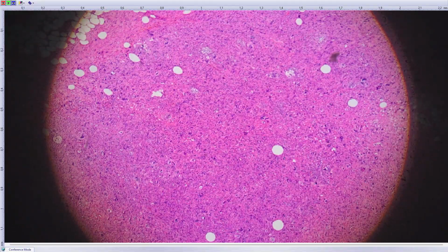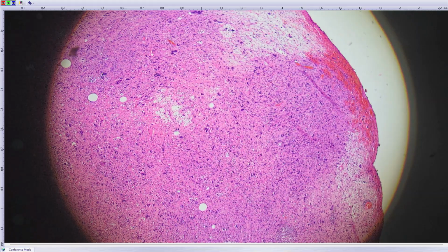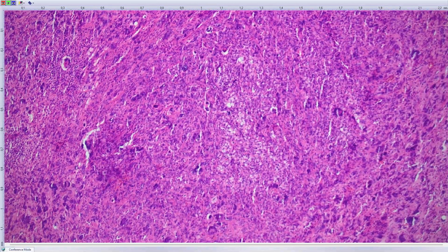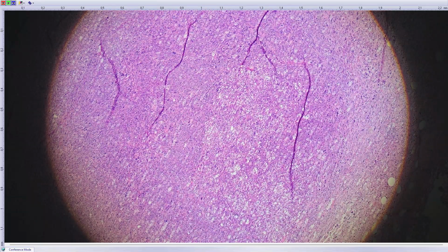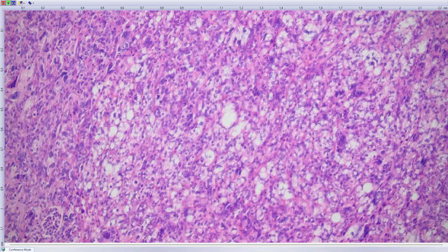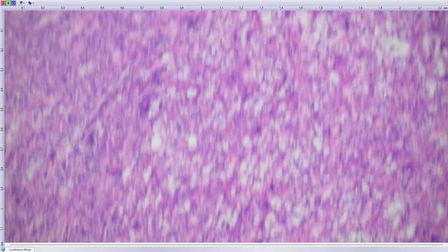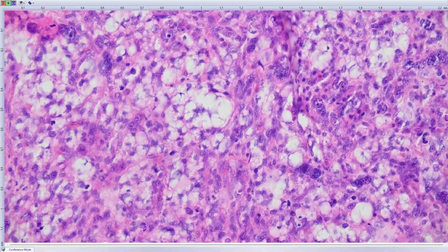So what else do we have here? So basically, undifferentiated pleomorphic sarcoma-like looking neoplasm. There seems to be adipocytic differentiation in some places, such as here. I have one more slide where it's more pretty. This is the original slide. It was more of the basically adipocytic or lipoblastic differentiation. Here it is one multivacuolated lipoblast.